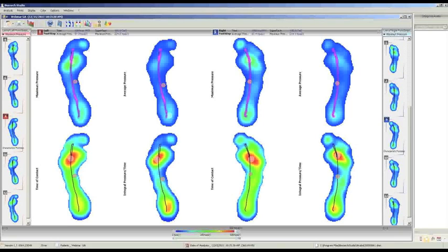On another part of the screen, we can see — always in color — the distribution of time of contact, so which part of the foot has been in contact with the platform for the most time. We also have an evaluation that integrates the pressure over time. This is the first screen you see when you click Save and Display. You can navigate through all the different sections — there are eight sections for this particular report.